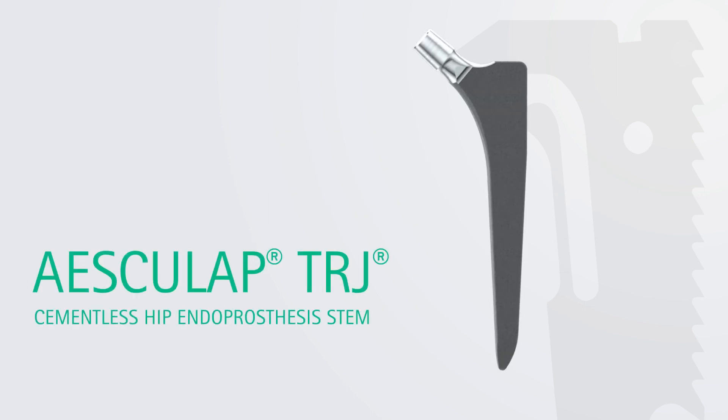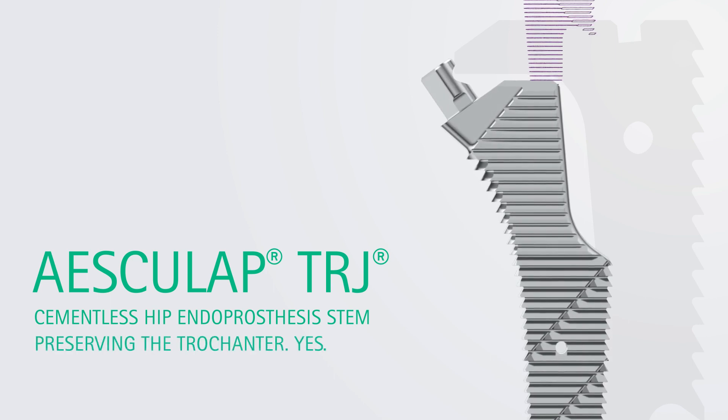Esculap TRJ cementless hip endoprosthesis stem. Preserving the trochanter.